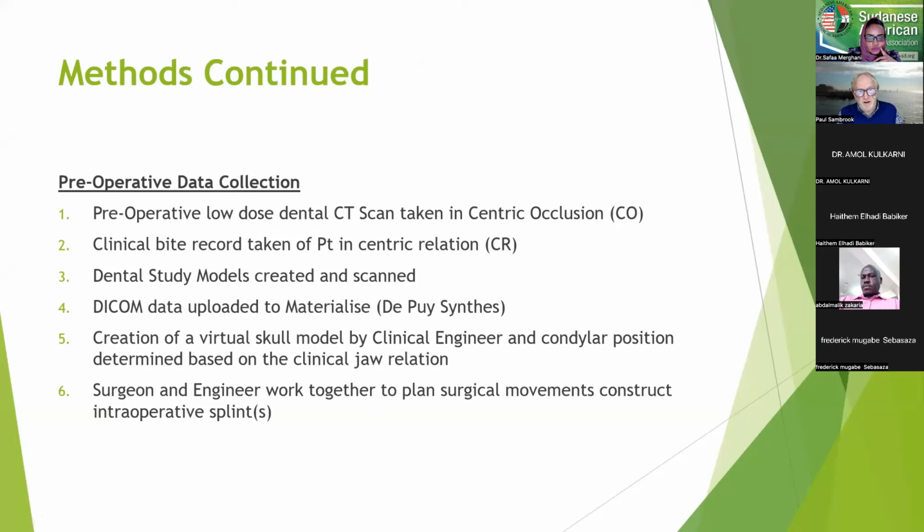We had a preoperative low-dose dental CT scan taken in centric occlusion, a clinical bite record. We didn't have the opportunity to use an intraoral scanner, so we used dental study models and scanned those. We uploaded the DICOM data to Materialize, and thank our colleagues at DePuy Synthes. We created a virtual skull model by a clinical engineer, and then looked at condylar position based on the clinical jaw relations that we had. And then the surgeon and engineer worked together to plan surgical movements.